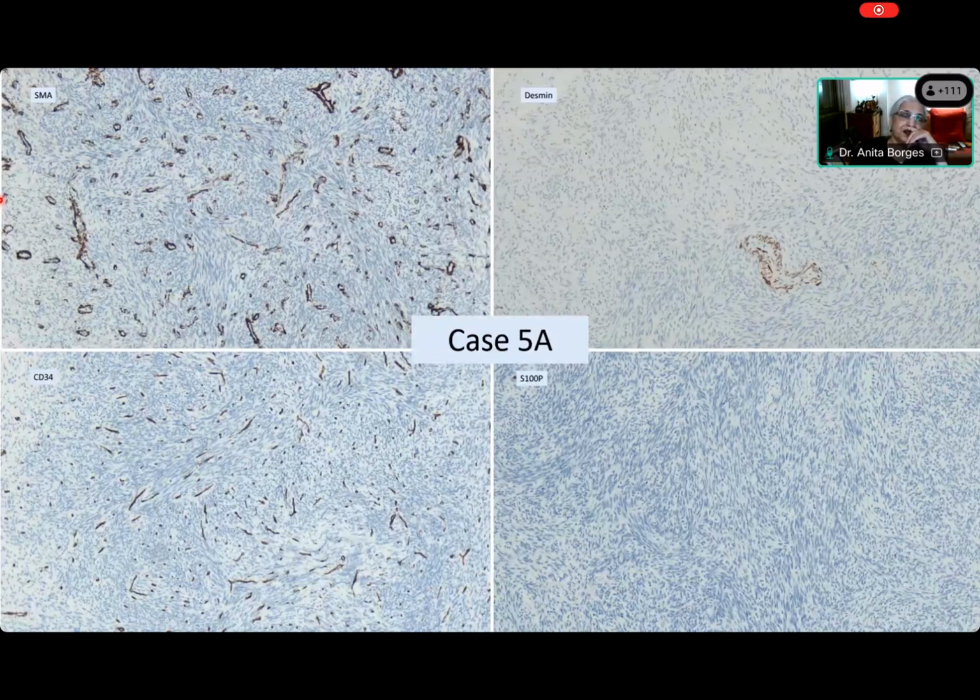Now let's look at 5A. Come on, read this now. I'm showing you the immunos. SMA. The cells are negative. Very good. What is positive? The vessels. Yeah, so it's an internal control. Yes, very good. Vessel walls are positive. What about this? Desmin also negative, ma'am. Very good. Desmin is negative. Excellent. And CD34 also control as vessels are positive. Excellent. Then S100 negative, ma'am. Yeah, so 34 is negative, S100 is negative.